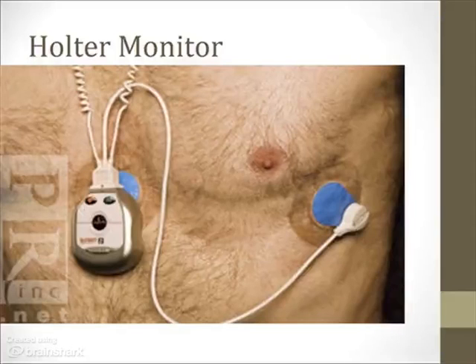The Holter monitor can be used to detect dysrhythmias, exercise intolerance, chest pain, dizziness, palpitation, and syncope or dizziness. It can also be used to evaluate medication regimens and therapies, and to evaluate the function of a pacemaker.